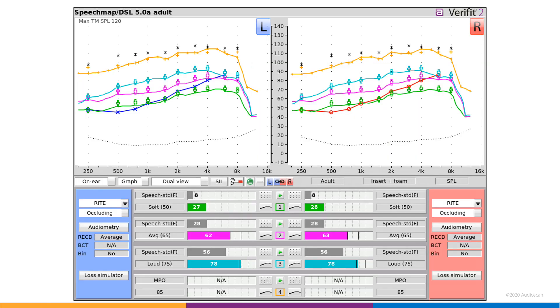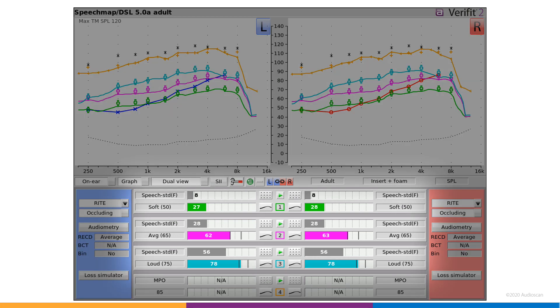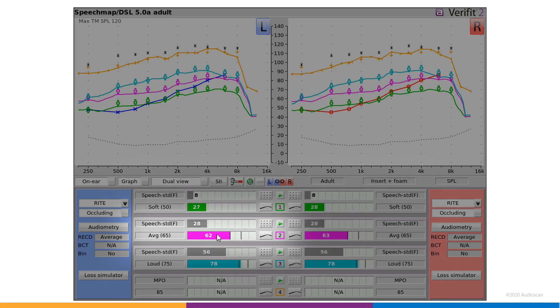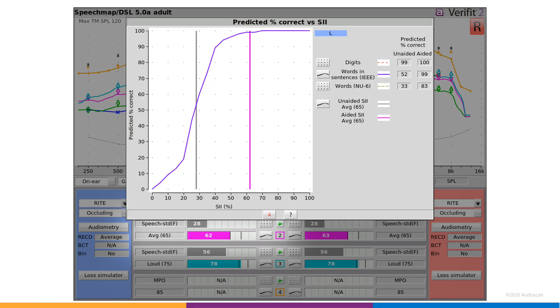For the 2020.1 software update for Verifit 2 and Axiom, we've built a tool which makes this information easier to access right from the SpeechMap screen. The new feature is accessed by clicking on any of the Audubars showing an SII score. In this case, I'll click on Test 2 for the left here, which is showing an SII of 62 for the aided result and 28 for unaided. Clicking on either of these will bring up a separate window.